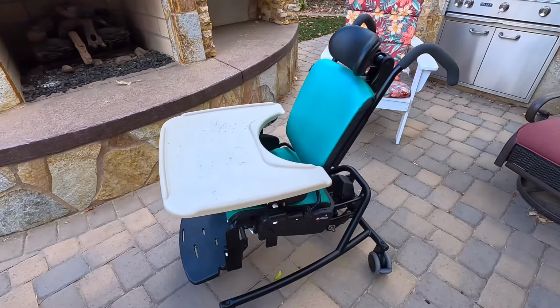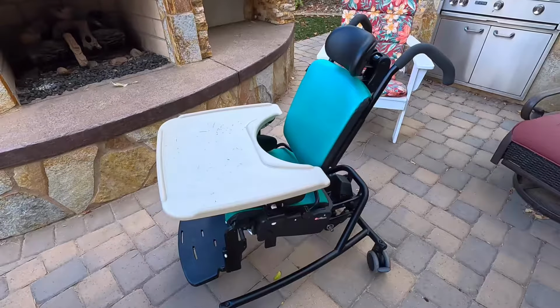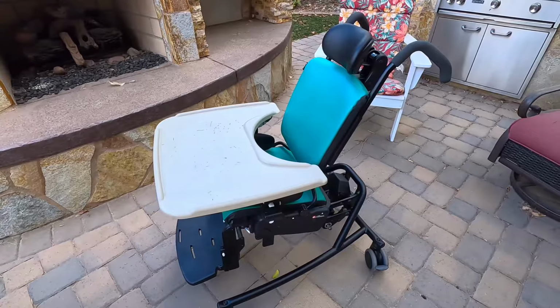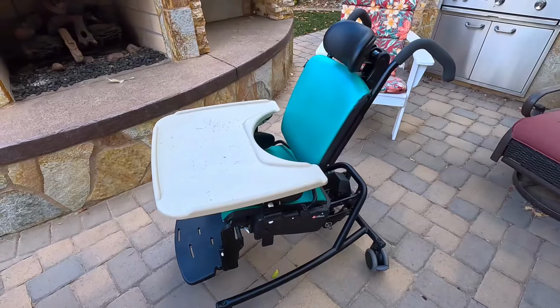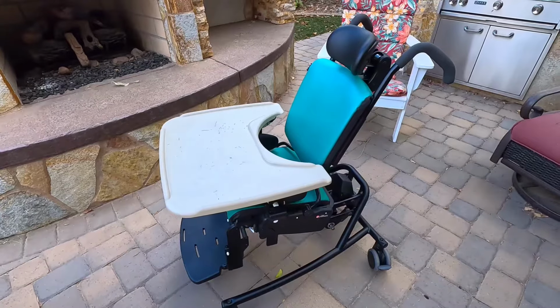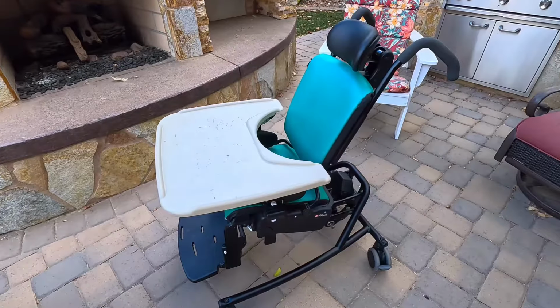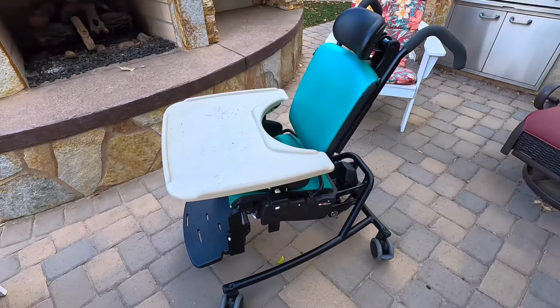So now we'll demonstrate the process for Billy to get into the chair. Very easy steps. The most important thing will always be to secure the chair. The wheels, the casters, are designed to move very easily for moving the chair around. So if the casters are not locked down, then when he tries to get in the chair or get out of the chair, it will take off from him, which would put him at risk of a likely fall.